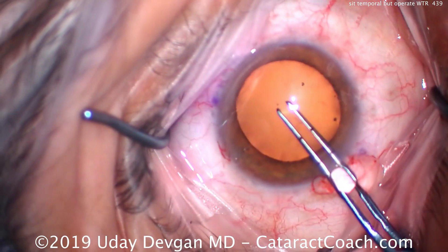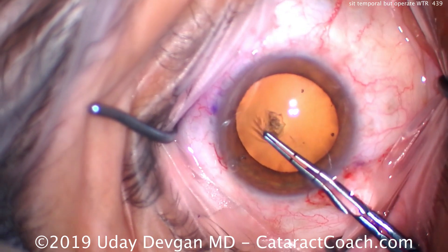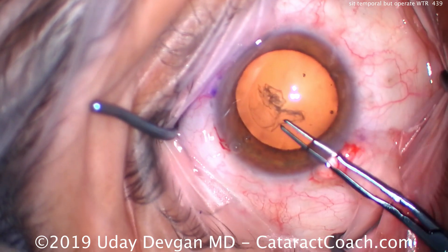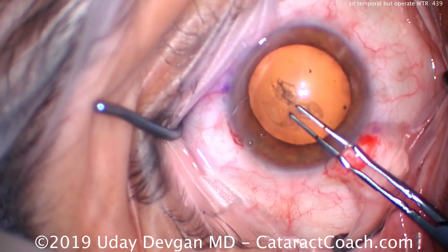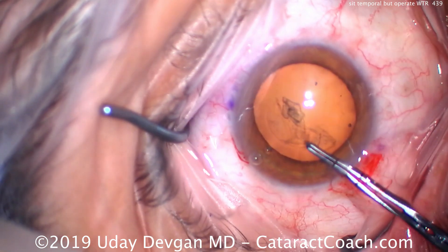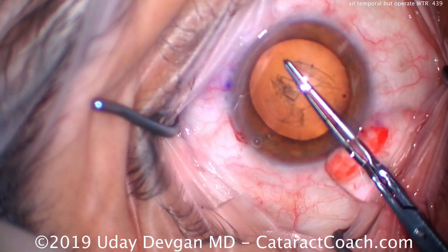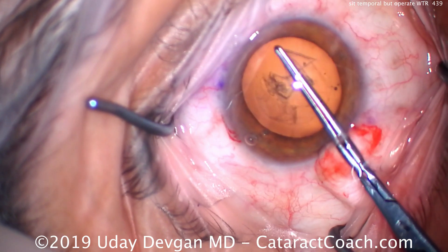We'll spin the speculum around a little bit — there are the forceps. We're going to start doing our rhexis. The case will proceed normally. In this case we're going to do paired incisions: one incision at 75 degrees inferiorly, and then at the end of the case when the IOL is in the capsular bag, we'll make a second incision at 75 degrees superiorly.